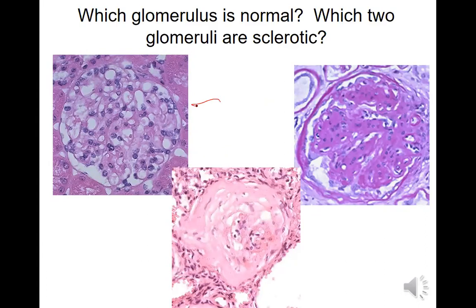This is normal, right? This is a really good one. I mean, it's a really bad one, but it's a good example of glomerulosclerosis at that magnification, right? That histology. This also is glomerulosclerosis. Note that difference. Very simple when you have this nice picture, right?